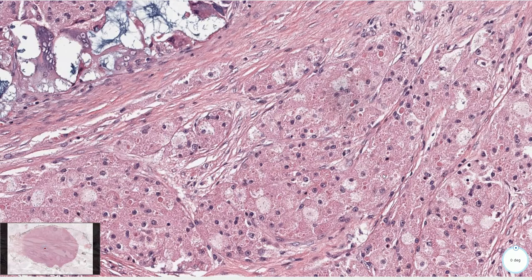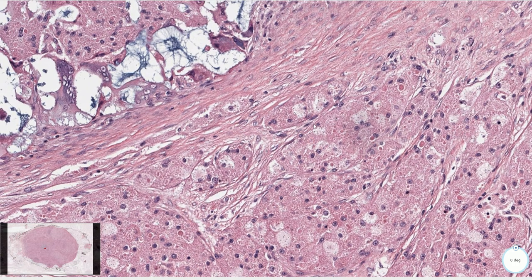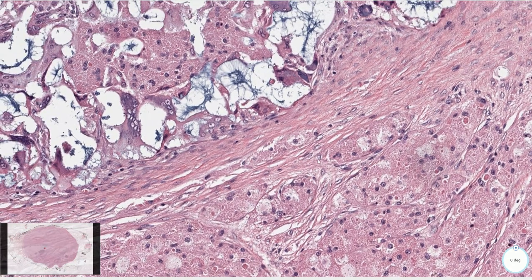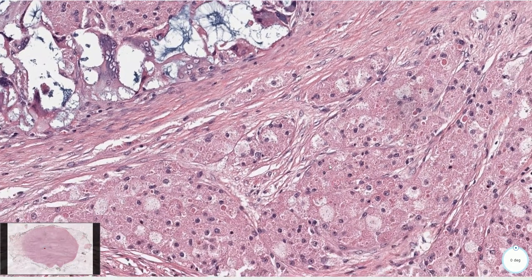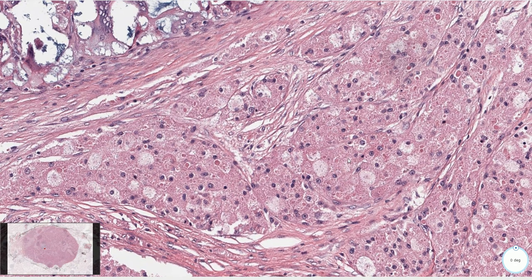The differential diagnosis includes inflammatory lesions and invasive carcinomas, including invasive carcinomas with histiocyte or histiocytoid features. Macrophages would be S100 negative and CD68 positive, while cells of carcinoma would be cytokeratin positive and also S100 negative.